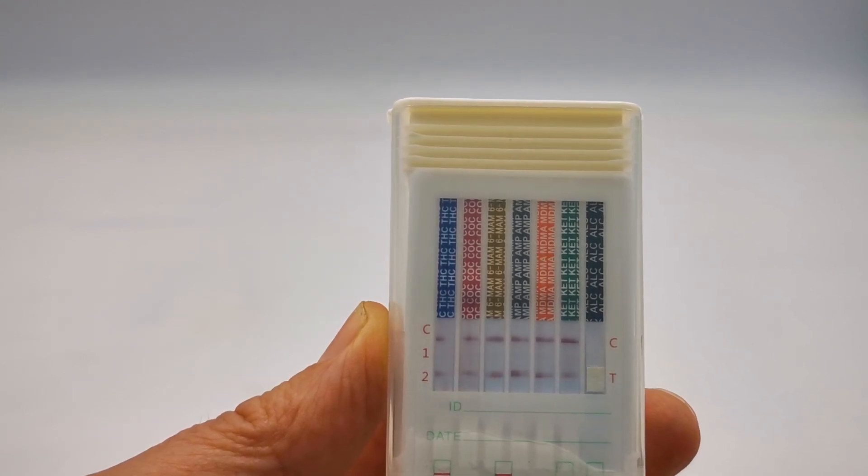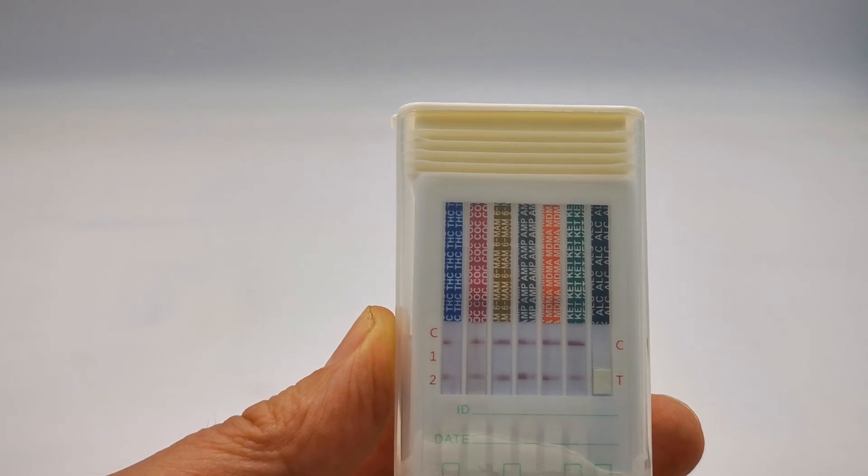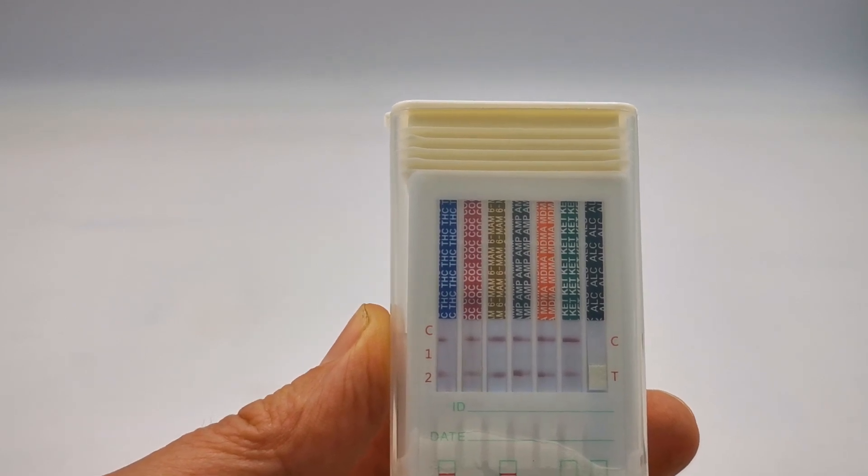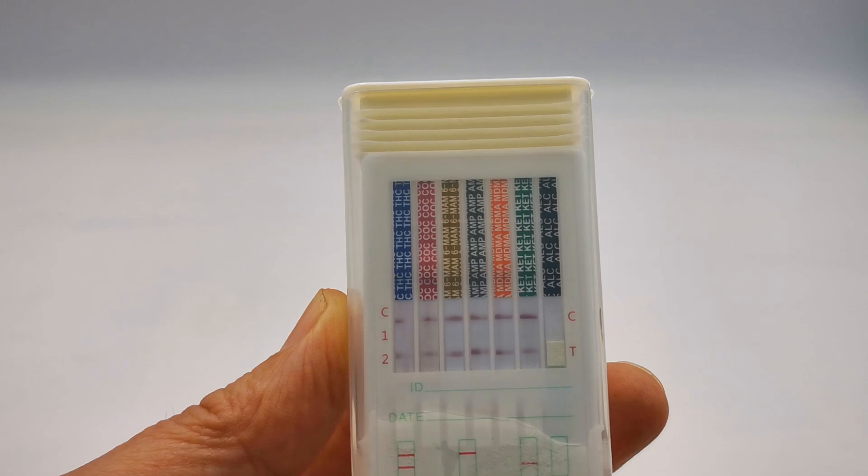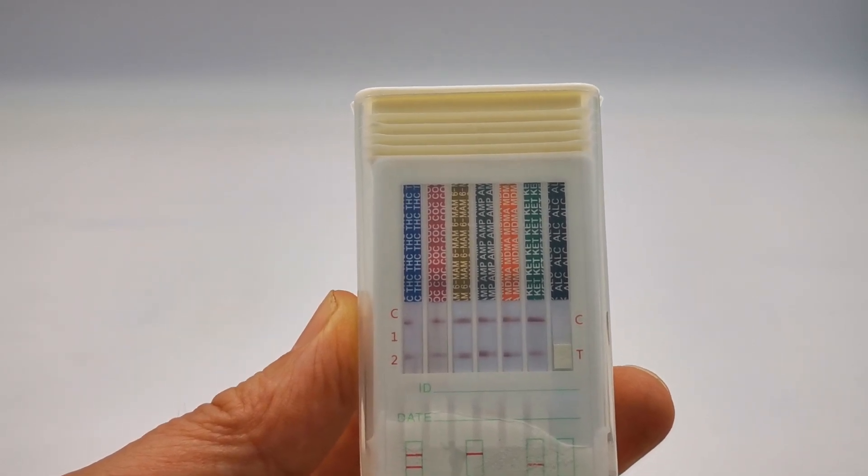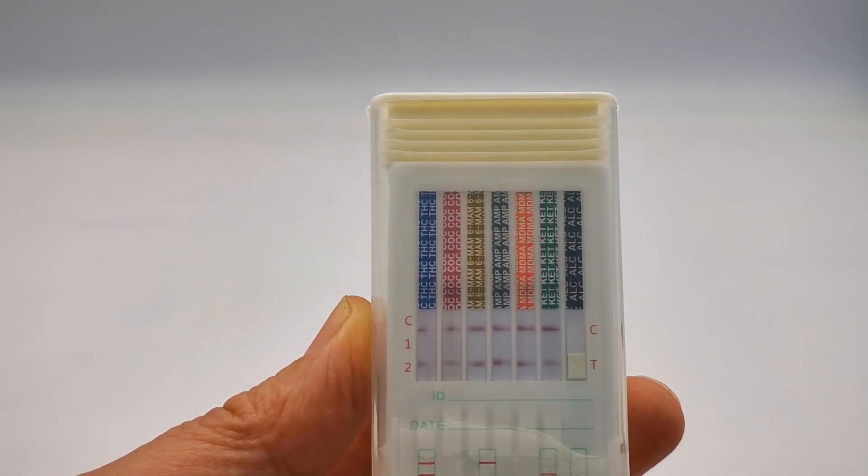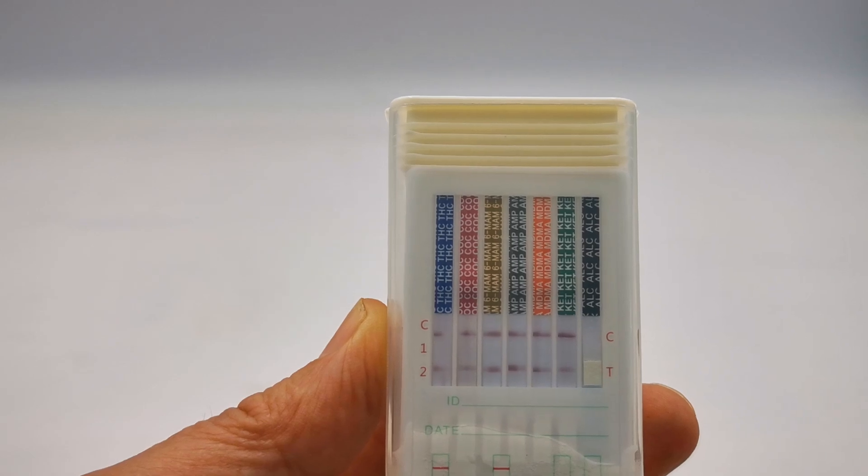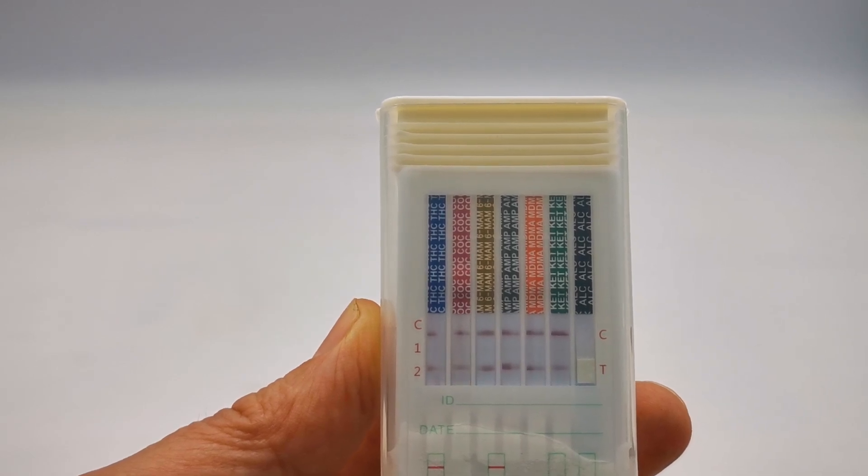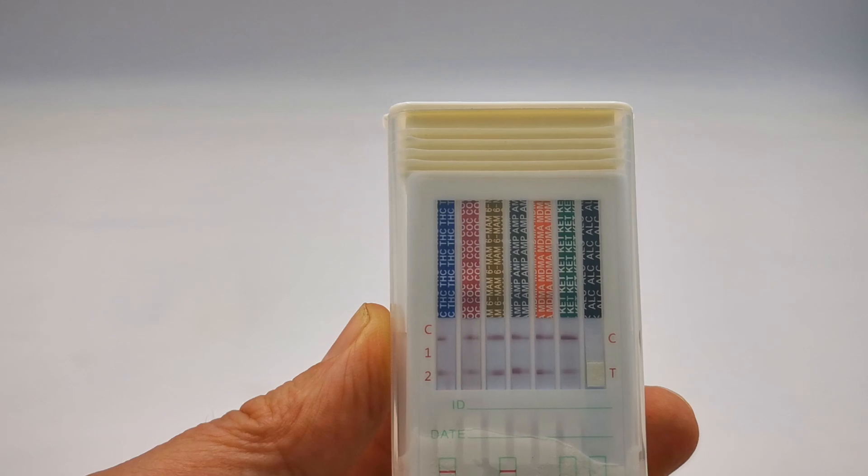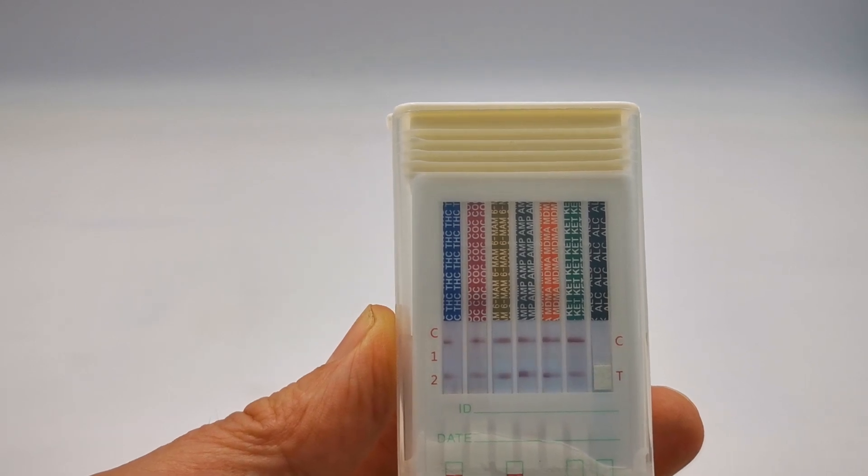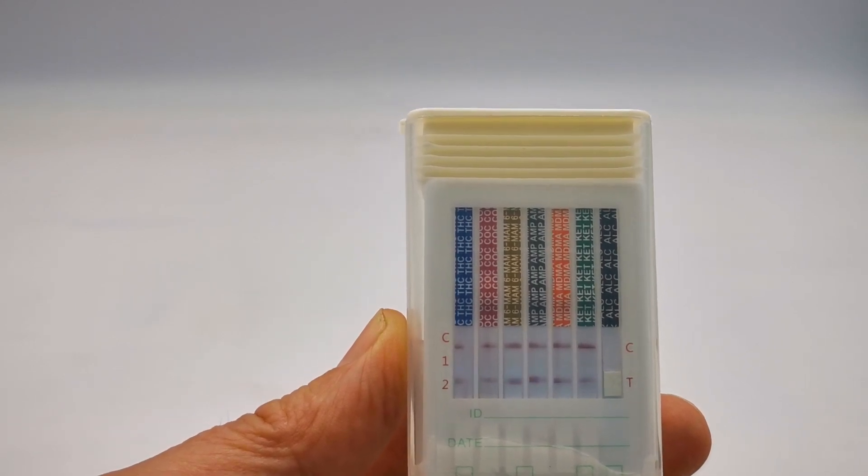It is important that you give it a full eight minutes development time for that test line to develop. But if the test lines and control lines have shown up much earlier, say two or three minutes, they're not going to disappear, so you can interpret that as a clear negative result as early as two to three minutes. If you want to read the results that early you can, but do allow eight minutes development for a test line to form.